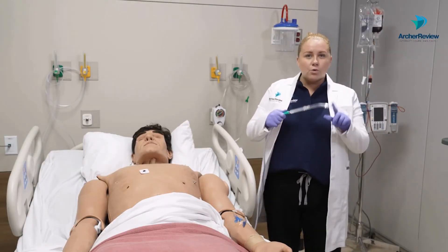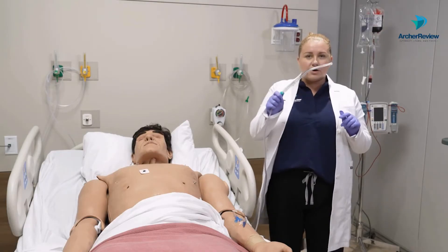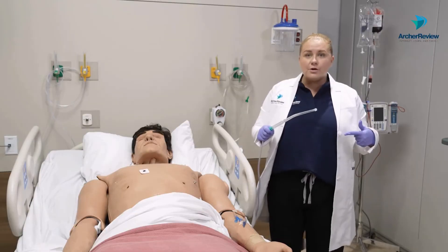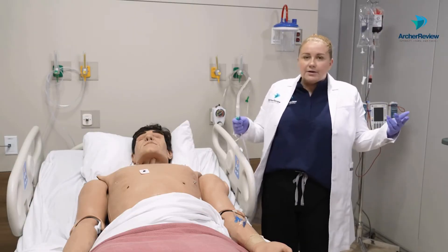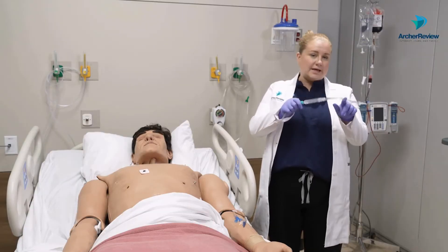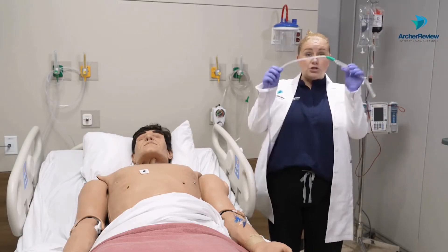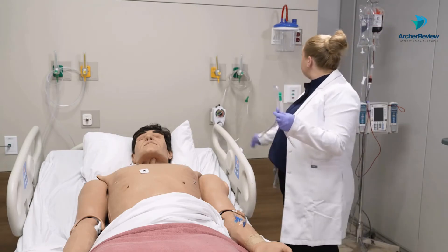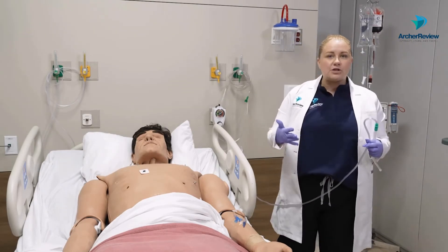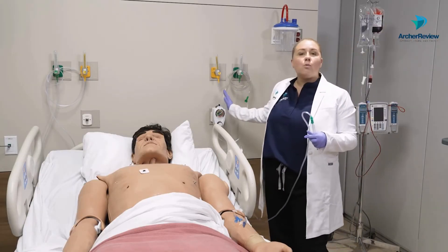For oral suctioning in adults, we most often use this little clear device. I have always called it a yonker — it can also be called an argyle, kind of dependent on what your hospital stocks, but they all look pretty much like this. They just get hooked up to your suction tubing that then needs to go over to your suction canister.